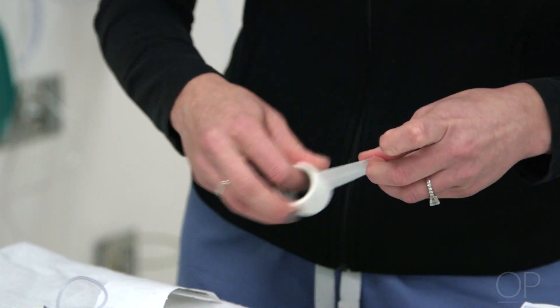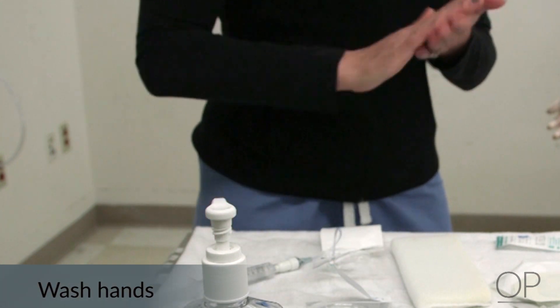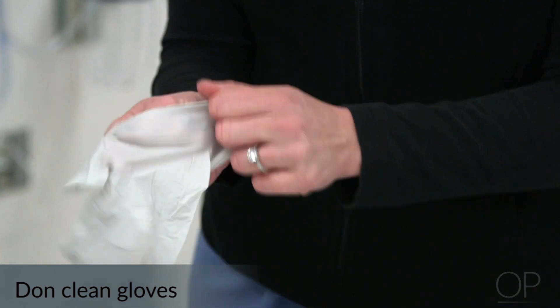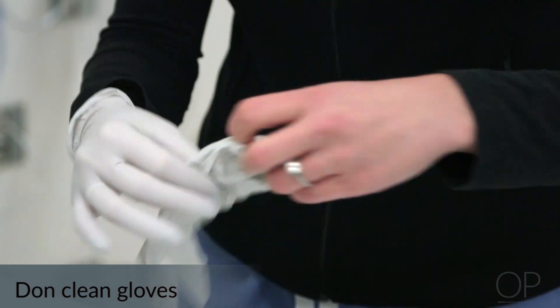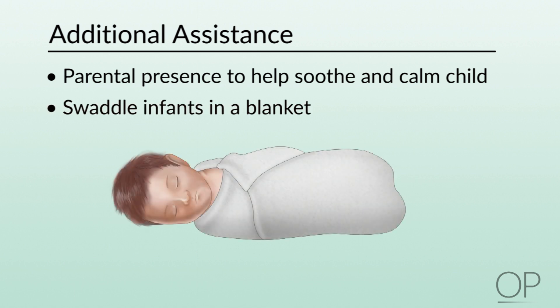Wash your hands with an alcohol-based hand sanitizer or soap and water. Then put on your clean gloves — it is not necessary to use sterile gloves for this procedure. Recruit other people to help hold the child if necessary. If possible, have parents present to help soothe and calm the child. For infants, it can often help to swaddle them in a blanket.